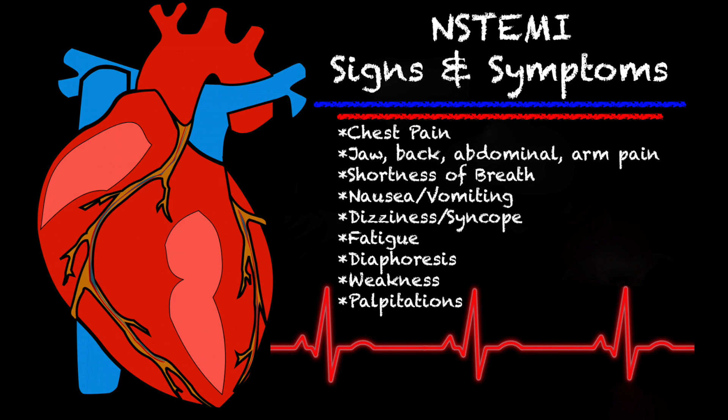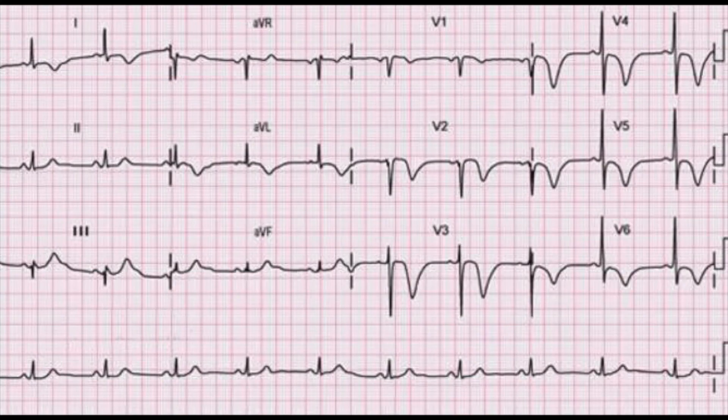Let's take a quick look at some of the changes you may see, if any, on an NSTEMI EKG. Just taking a quick glance at this, we're seeing obvious T-wave inversion in V1, V2, V3, V4, V5, V6, and also in lead I and AVL — so we are seeing a lot of T-wave inversion. In other EKGs, you may see very slight T-wave inversion and very slight ST depression, which is why it's so hard to identify.